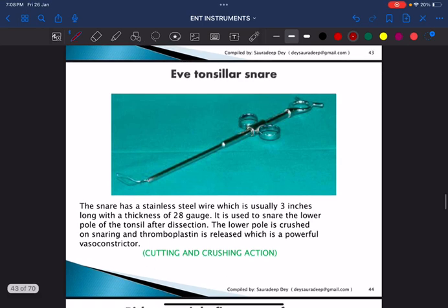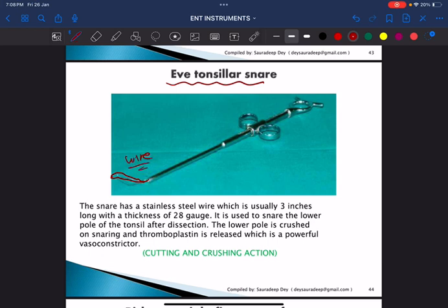This is Eve's tonsillar snare. It consists of a wire used for cutting and crushing the tonsil. This instrument is called Eve's tonsillar snare.